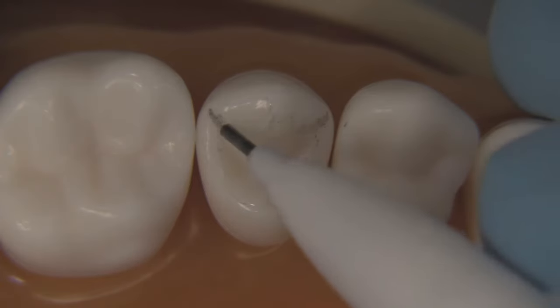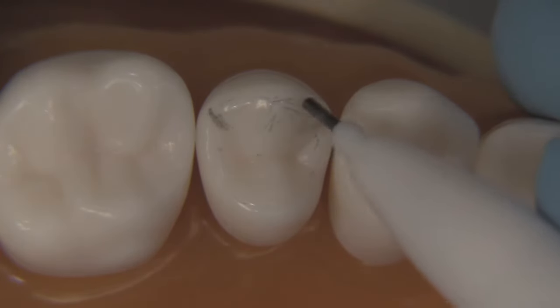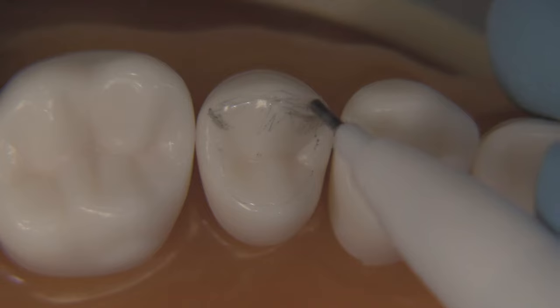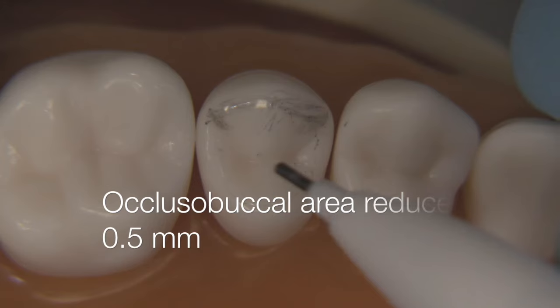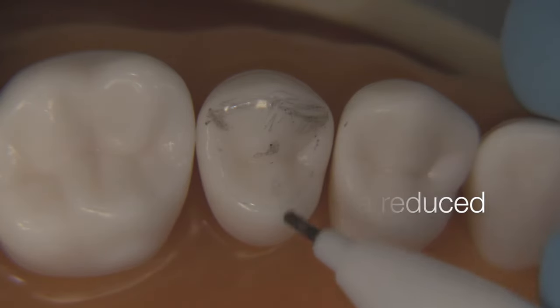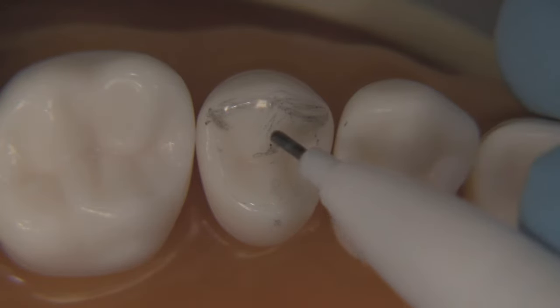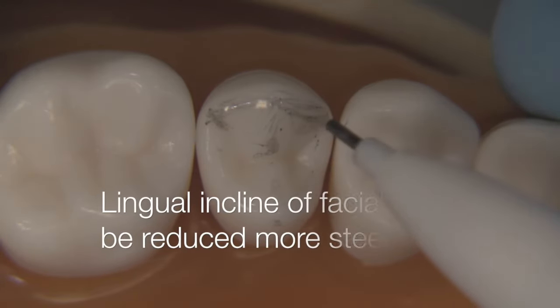Another thing to keep in mind is that the lingual incline of the facial cusp is not reduced quite as much as the B-plane and the A-plane on the lingual side, which is more steeply reduced. We're going to keep that area under-prepared compared to the middle and the two areas back in here where we're going to be reducing 1.5 millimeters, yet at the cusp tip we're only going to be reducing about 0.5 millimeters. That provides a much more steep reduction plane on that facial cusp.